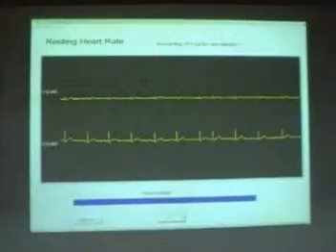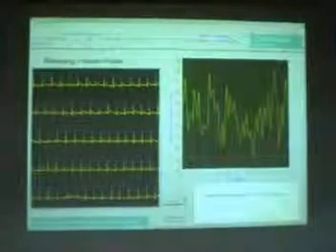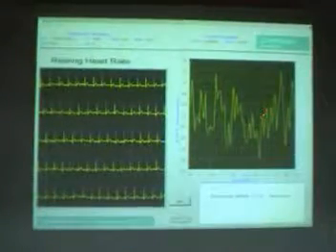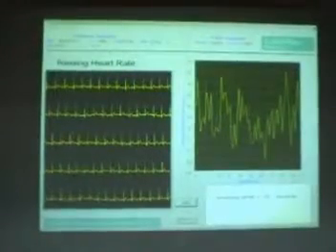The resting heart rate is recorded for the entire 1 minute. And this is the report of the resting heart rate. And this is the variations in the heart rate which is depicted here. The resting heart rate is 73 per minute for this patient. Now we will go on to the second test, which will analyze the heart rate response to deep breathing.